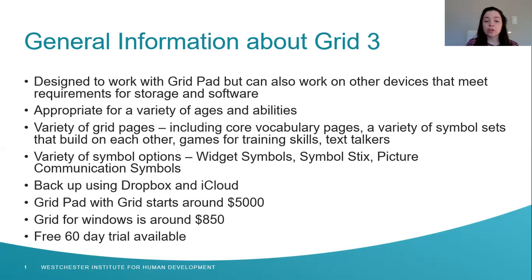You can back up using Dropbox and iCloud. The grid pad with grid starts around $5,000, and the grid for Windows is around $850. There's a free 60-day trial available through the website.